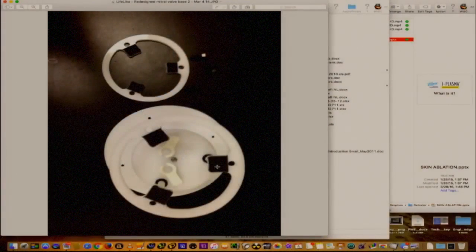We had synthetic, we had 3D models of it. I'm looking at it, and it was designed with 3 screws. You can see the little area here in which we secured the papillary muscles. These 3 black areas right here is actually sandpaper, because we wanted to create an area in which the LifeLike Biotissue model would be secured between 2 thin, hollow plates.